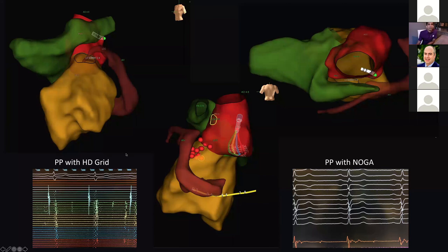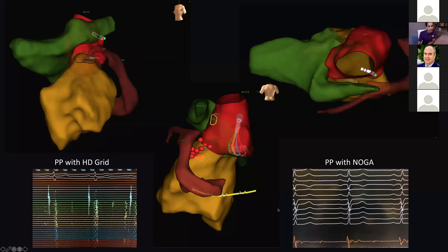Sometimes when you're mapping with high-fidelity catheters, you'll see pre-potentials. These are pre-potentials seen in sinus rhythm with the HD grid catheter and also with something called a Novastar catheter, which is a Carto-specific catheter. It's a little unclear what they mean — these may represent specialized conduction fibers connecting the arrhythmogenic site to the site of exit. These fibers may be insulated and pace mapping may be unreliable here.